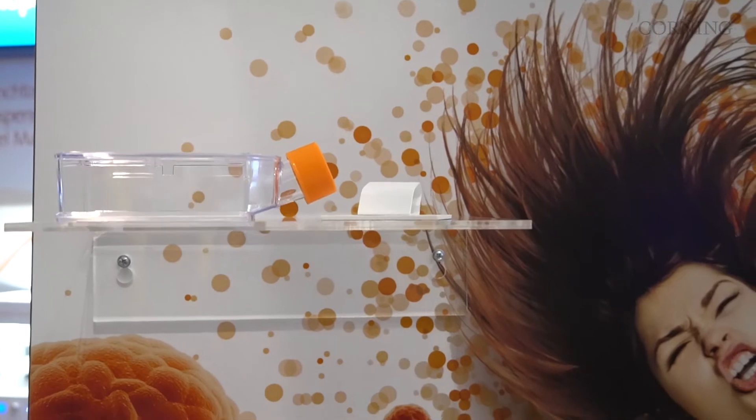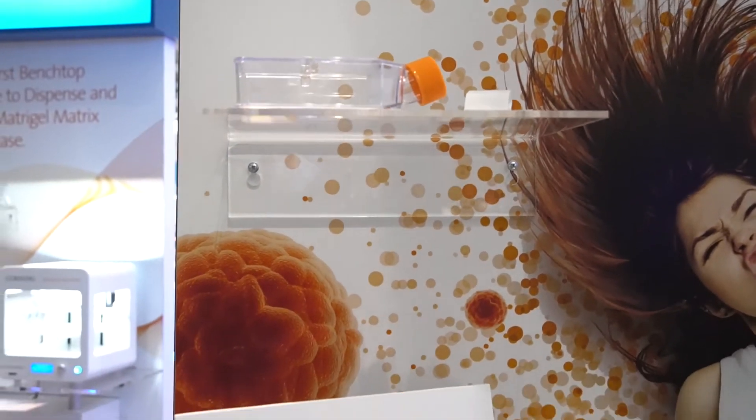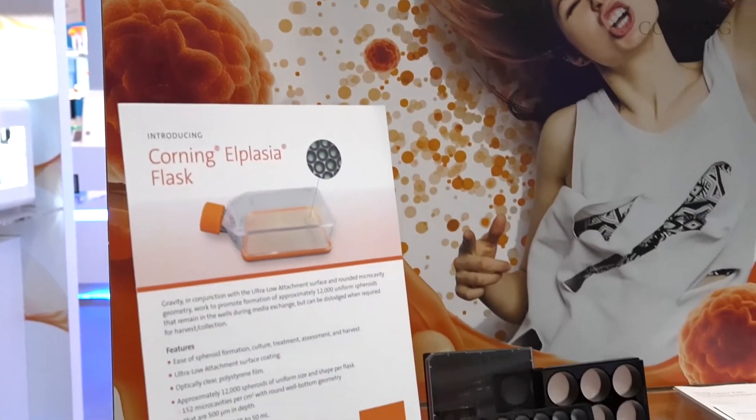To meet this challenge, Corning has developed the Corning Alplasia Flask. This flask features a substrate bottom with 152 micro cavities per centimeter squared, generating approximately 12,000 uniform spheroids in the footprint of a traditional T75 cell culture flask.